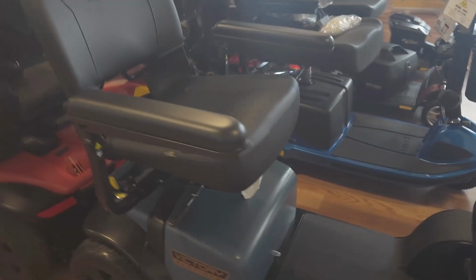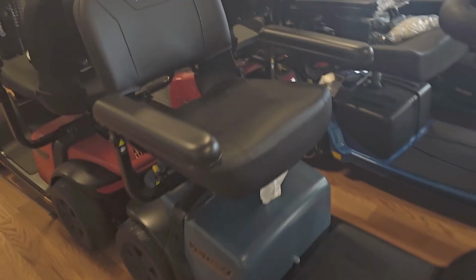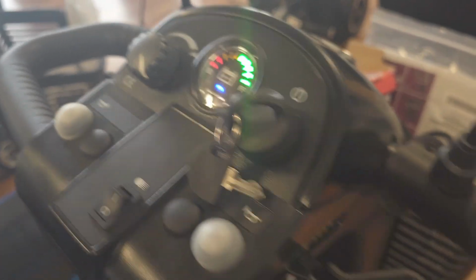So I'm going to flip this around. I'm just going to show you a couple examples. Right here, we're looking at a Victory Platinum scooter, a typical mid-size scooter. You're going to see a lot of these circuit breakers sitting right there in the center under the seat. It's just got a little rubber button type of cover there. So if this was popped out, you'd click it in, you would hear it click, and then you're going to want to check to make sure it powers on.